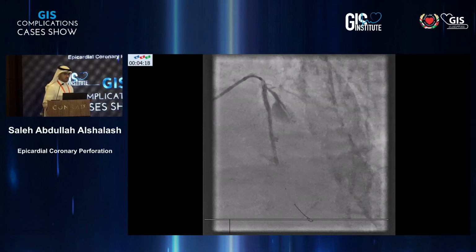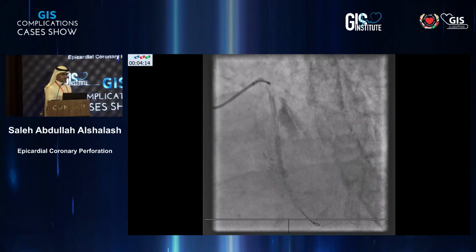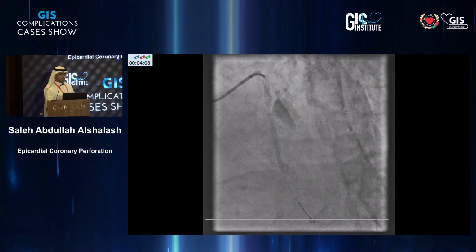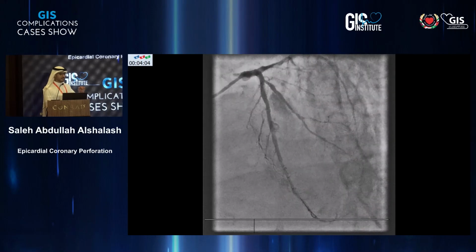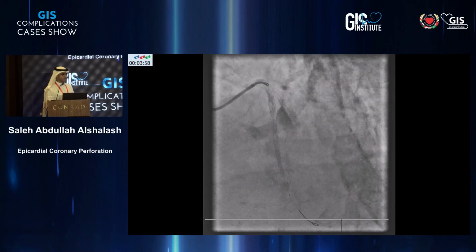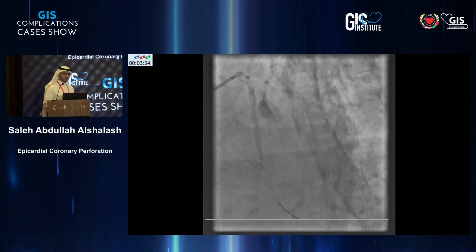This is the final angiogram. And I think, based on this view, that the blood is exiting into a space, maybe a pericardial fat, and then draining in a vein near the diagonal. So it's definitely not collecting, it's just some sort of an AV fistula. Overnight, he did very, very well.